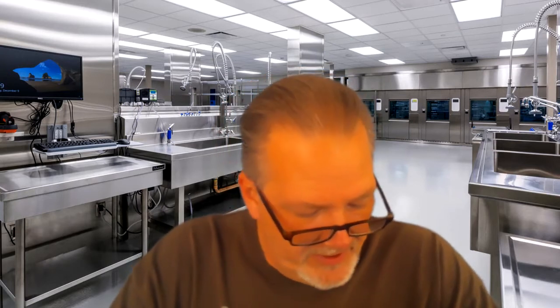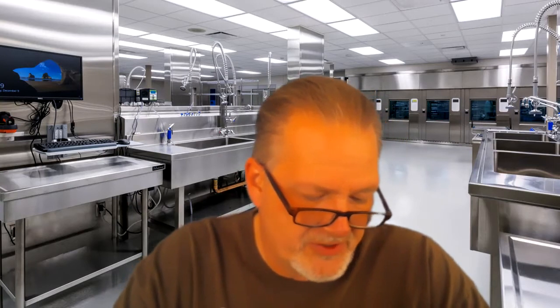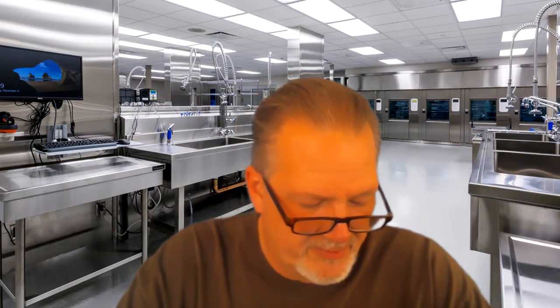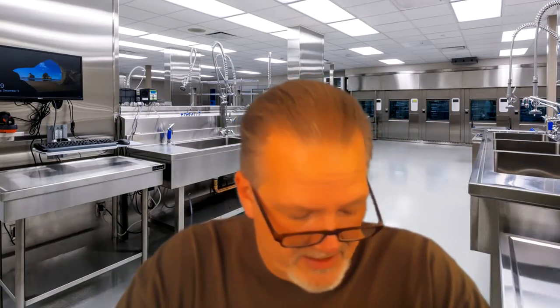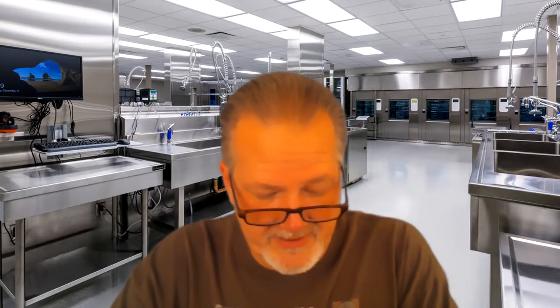The goals of point of use preparation and transport are: you should remove gross soil. One goal is to prevent damage of the instruments. Another goal is to prevent cross-contamination. And another goal is to keep other people safe. So as I stated earlier, the operating room is where the majority of the contaminated instruments come from. There are other places where contaminated instruments can come from. We're talking about labor and delivery, the catheterization lab, X-ray even can be a source for contaminated instruments.